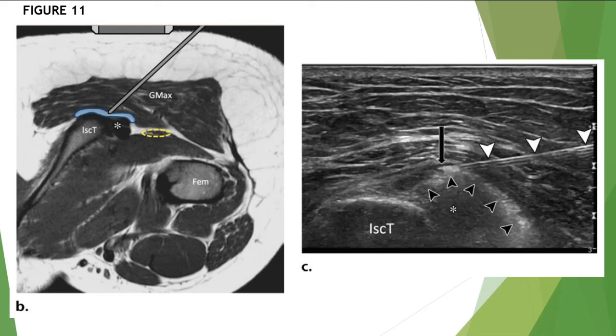The hamstring tendon origin is here marked by the asterisk. So here it's interesting that they injected a small amount of gas with the medication. It's showing a posterior acoustic shadowing, characteristic of any gas in ultrasound. So the shadow behind it can help us to delineate the anatomy of the bursa, which helps us then to know that we're in the right place. So yeah, it's making it easier to identify. I thought it was very interesting.